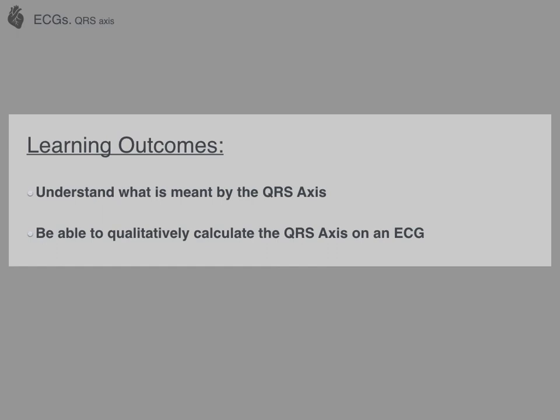So that's it for now. Hopefully now you have a greater understanding of what we mean by the QRS axis and would be able to qualitatively work out on an ECG what the QRS axis was.